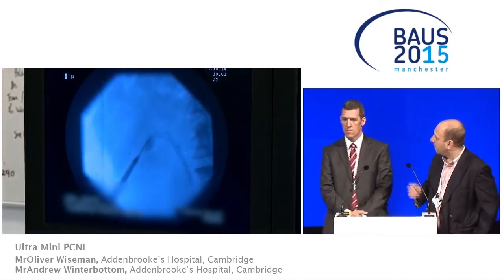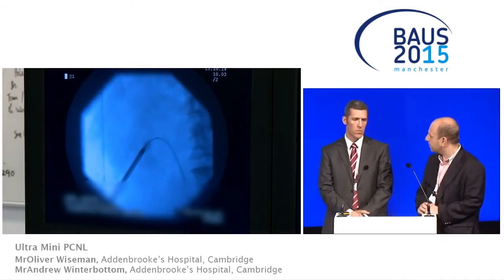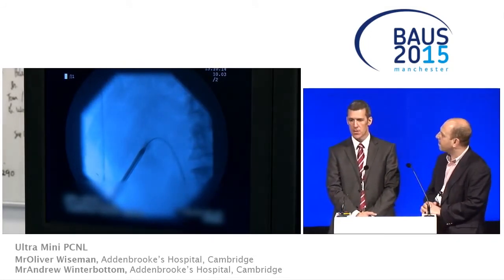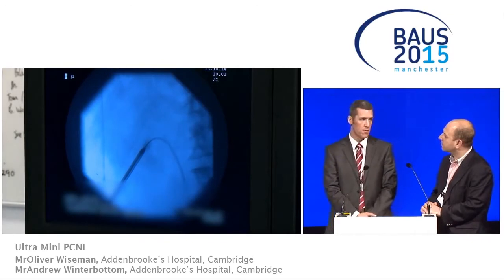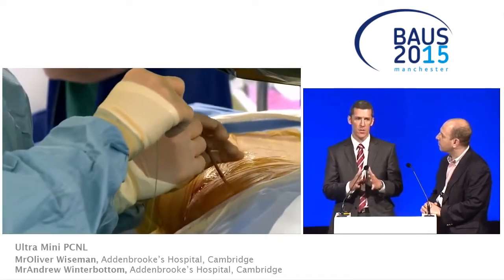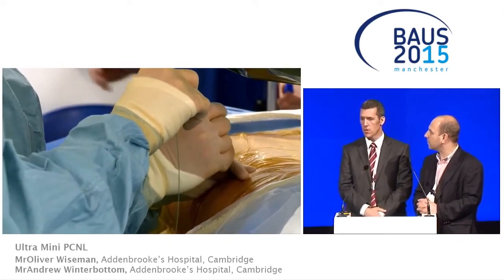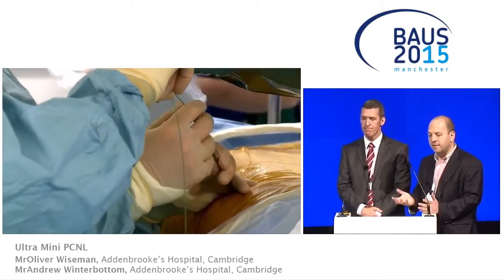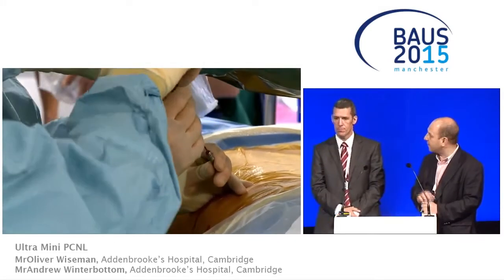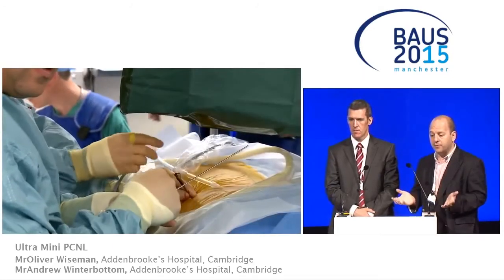So this is Andy again now getting access. You pre-dilate with an 8 and a 12 French dilator, and then this is the 13 French sheath going in. It's quite blunt on the front end, so you've got to be slightly careful. It's not as tapered as some dilators, so a little bit awkward when you're pushing in to make sure it goes in straight. So dilated into the kidney, the inner obturator comes out, and that leaves us with a guide wire there and the outer sheath.